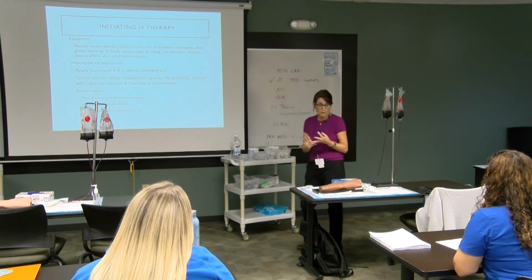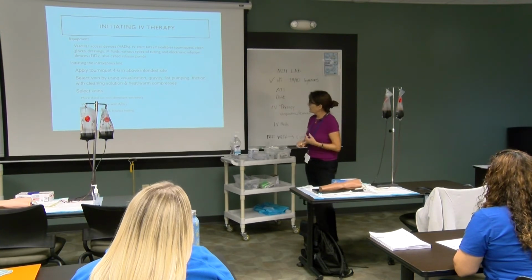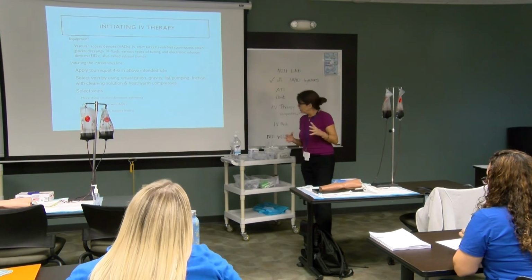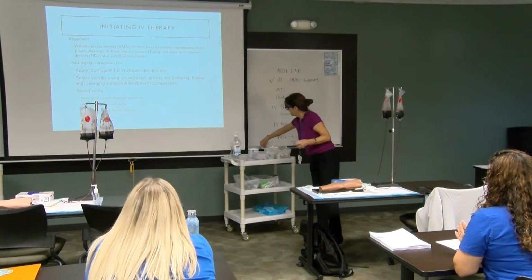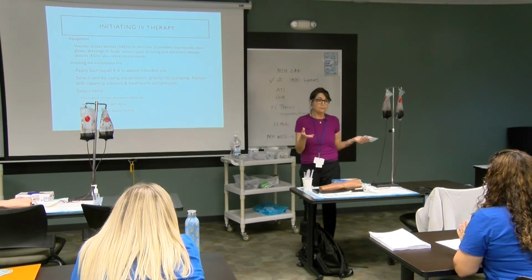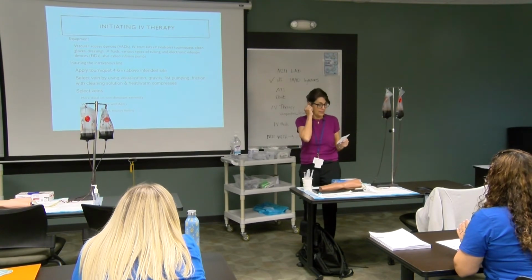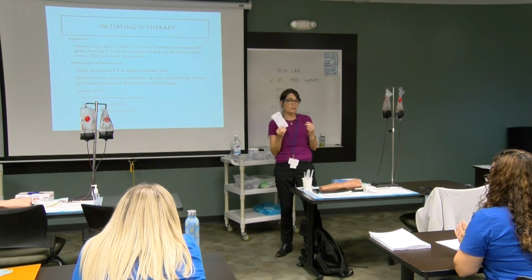So we need the catheter, the IV start kit, gloves, of course, and hand hygiene. You may start the IV with the fluid running, so you would have to prime the IV tubing, which we'll do in a bit, but most IVs now are started with what we call IV extension kits or J-loops.